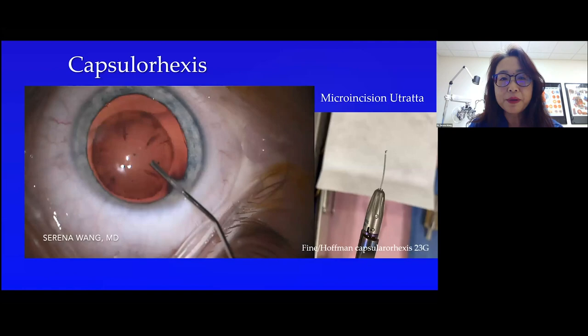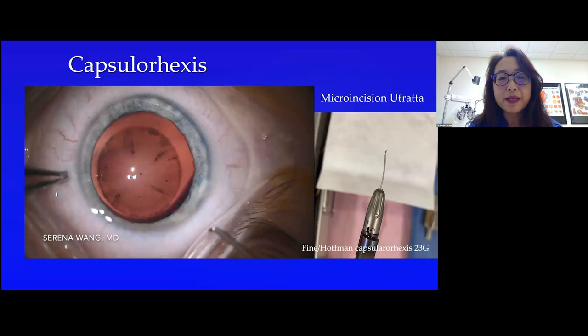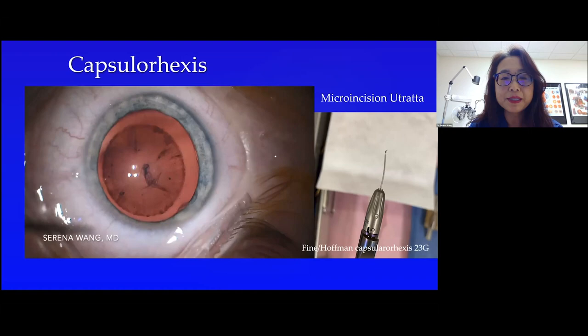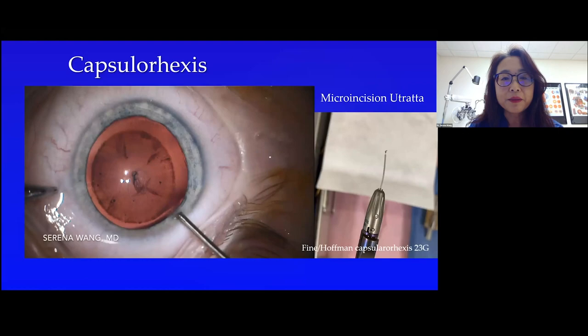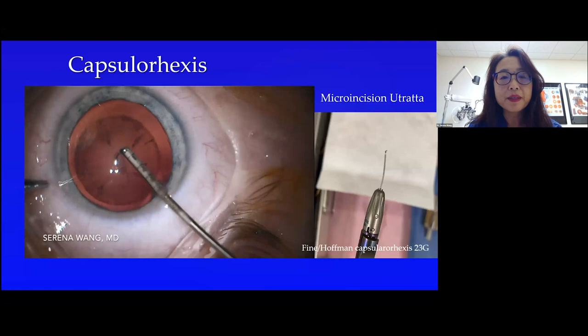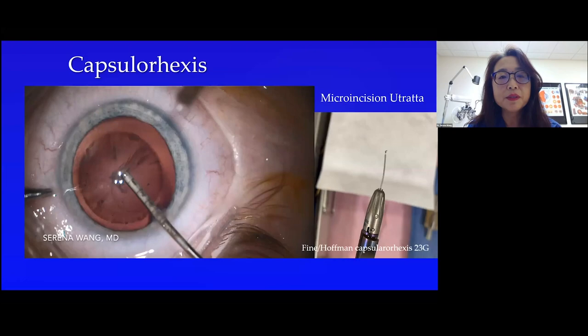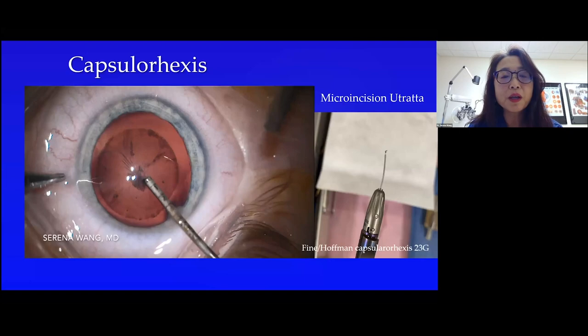Making a capsulorhexis is so much easier and more controlled than if you make a big incision to try to do this. Because this microincision forceps makes your anterior chamber very stable, which is pretty much the key for pediatric cataract, especially infantile cataract surgery, because their eyes are very soft, very bouncing, you know, unstable. If you keep your incision really small, this is much easier. Your capsulorhexis motions almost always pull toward the center, otherwise you will run out.